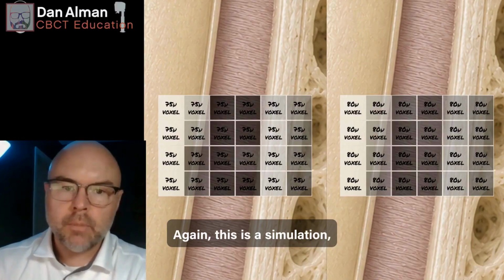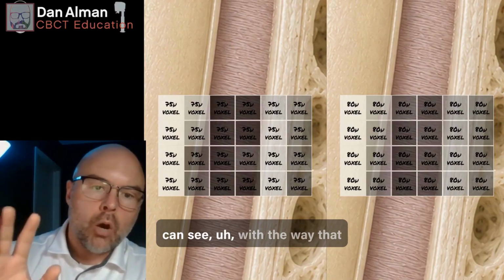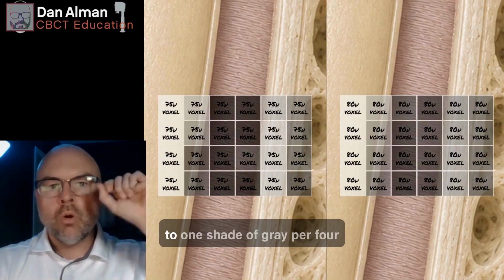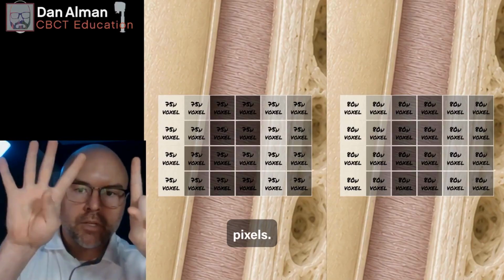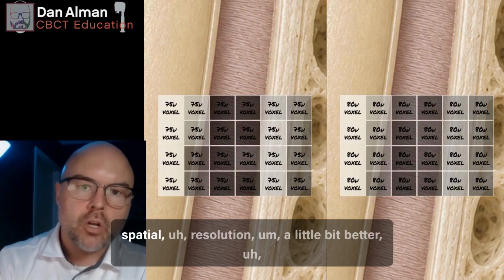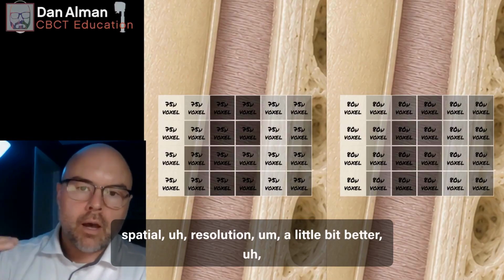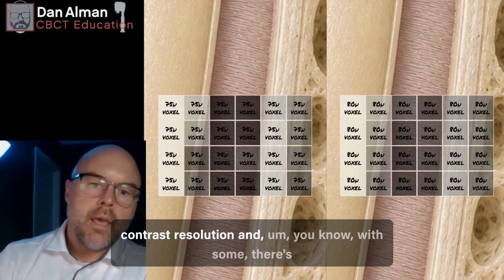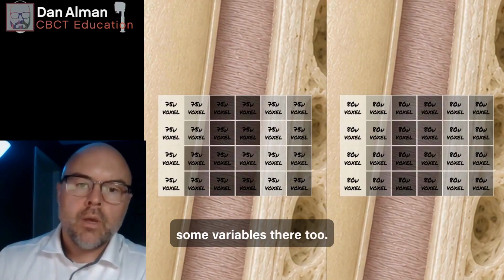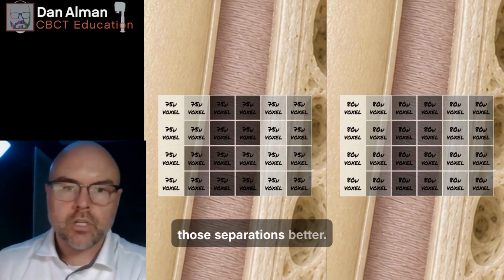Again, this is a simulation, but we can see with the way that we acquire it, one shade of gray per 1 pixel as opposed to one shade of gray per 4 pixels. We've got a much sharper spatial resolution, a little bit better contrast resolution, and there are some variables there too. But we are going to be able to see those separations better.